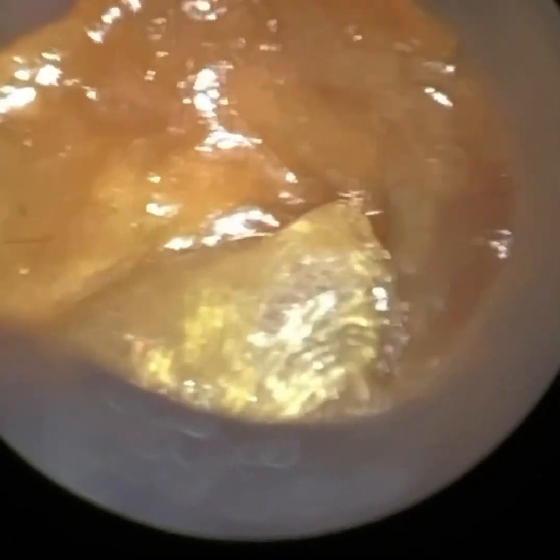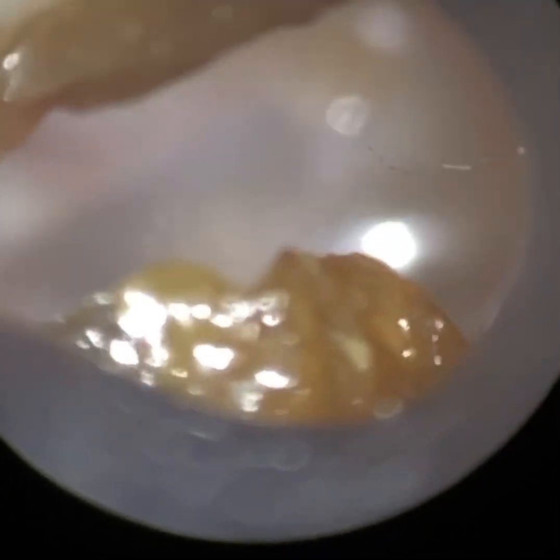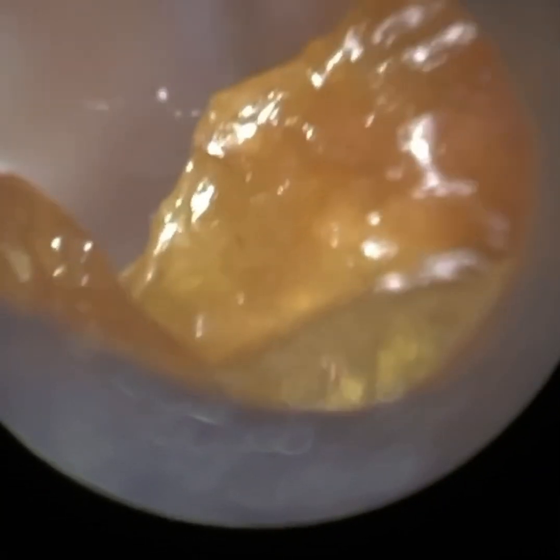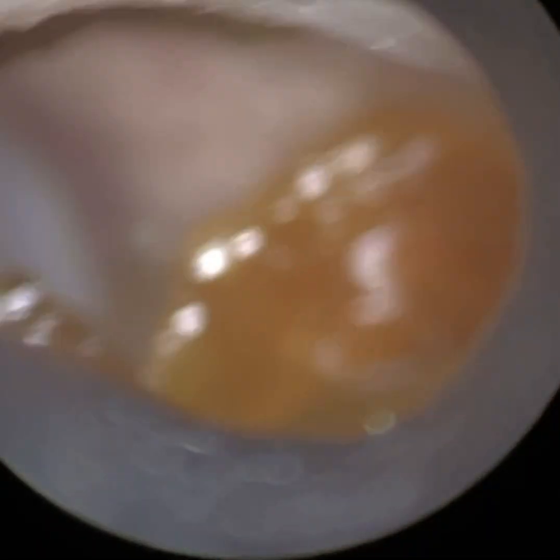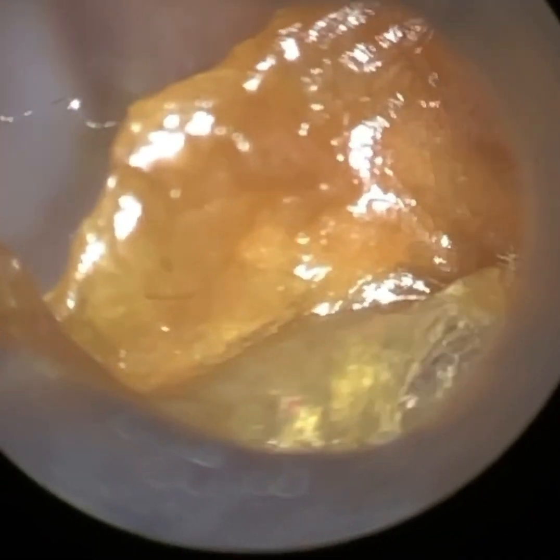And that was the brainchild behind developing the Waxscope. It's got a speculum attachment and they come in different sizes. We're using, I think this is the 4.25. We have got a smaller one, a 3.5, and two larger ones, a 5mm and a 5.75.